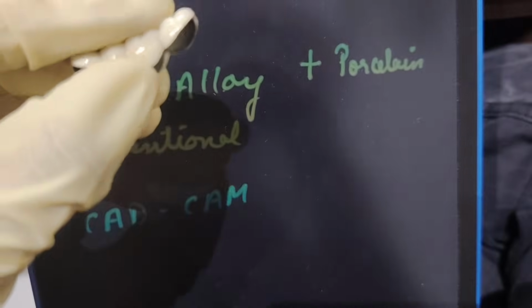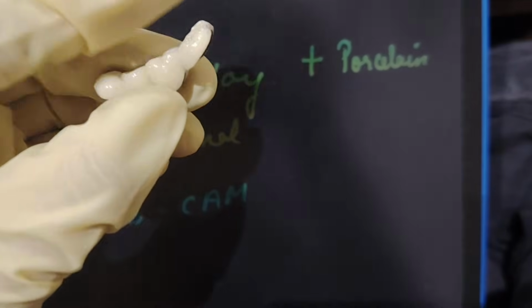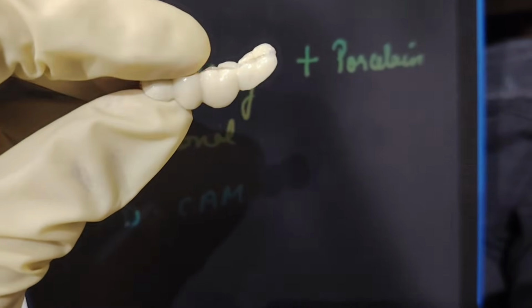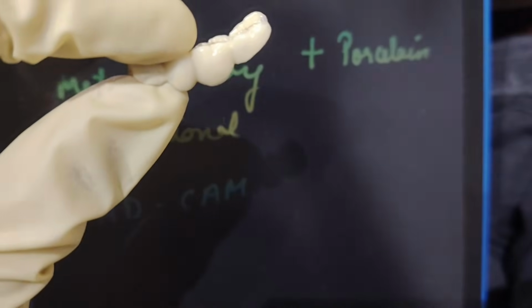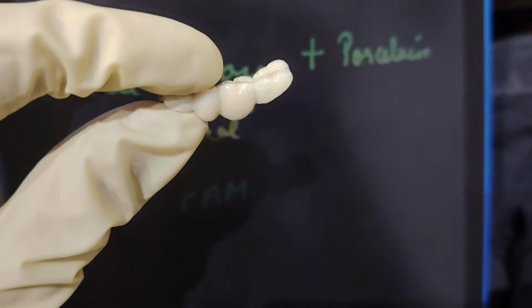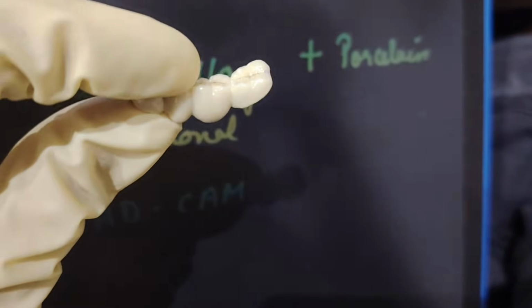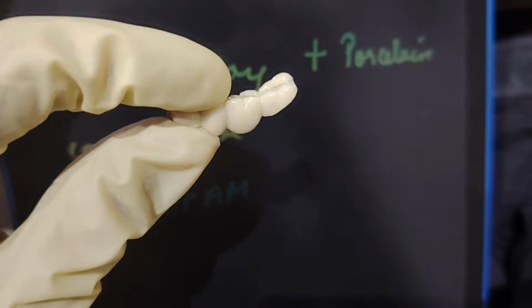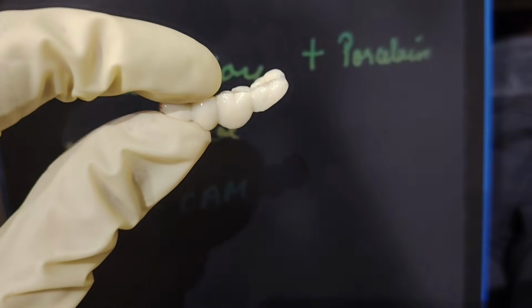Then it leaves a little grayish hue on the cervical third that can be seen with these, which is seen with all metal restorations that we do, either amalgam or any crown. If it is metal, it is going to leach some of the tarnish and corrosion products.